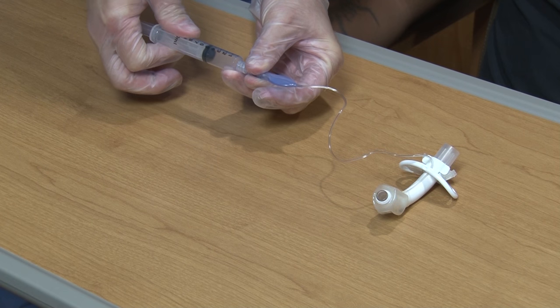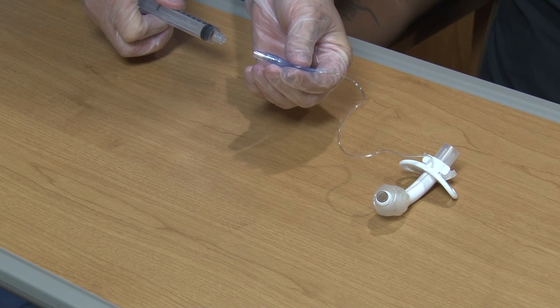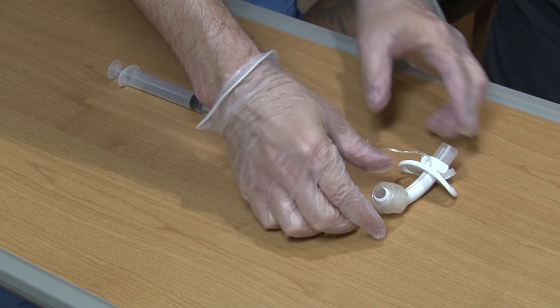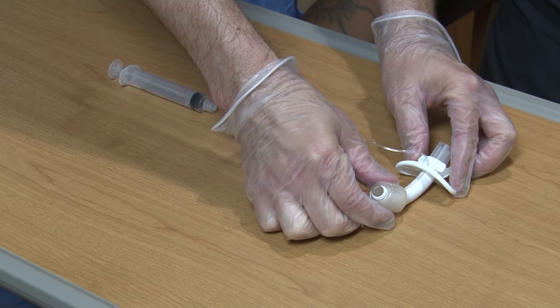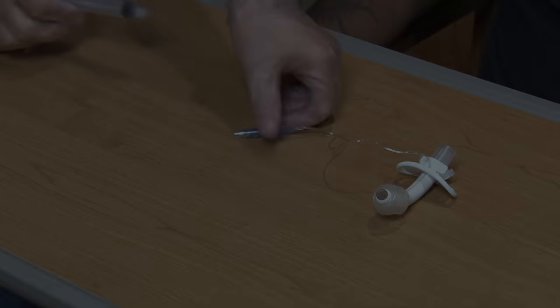The pilot balloon can be blown up or empty if you need a ventilator to breathe for you, need special breathing treatments, or have other special needs. Otherwise, you will have a cuffless tracheostomy tube in place.